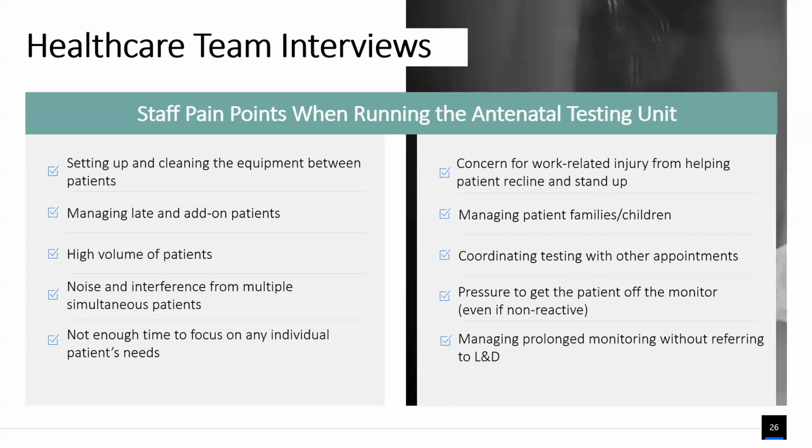And then this one people don't think as much about, but I think there's a lot to be said about, is that there's often a pressure. You put the patient on the monitor, but you don't have time for that patient to spend 30, 40 minutes to get reactive, especially if they were late and you have a big schedule. So you feel this pressure from the beginning. This patient's got to get off the monitor. And there are some things you can do to help.